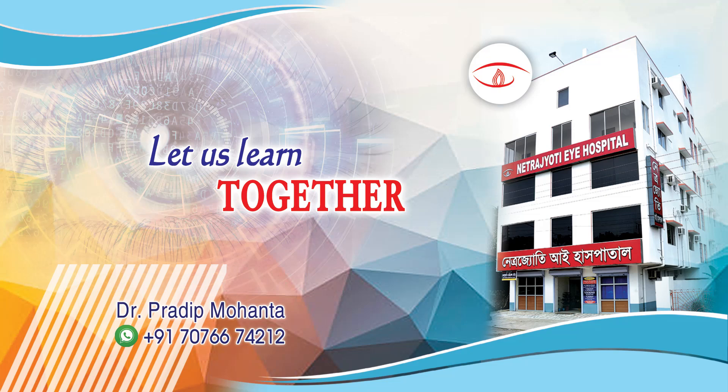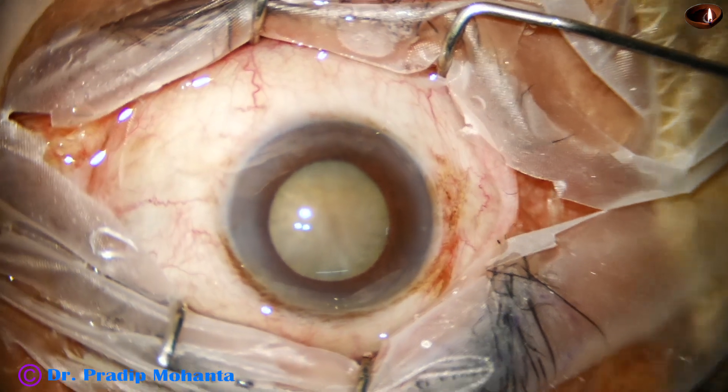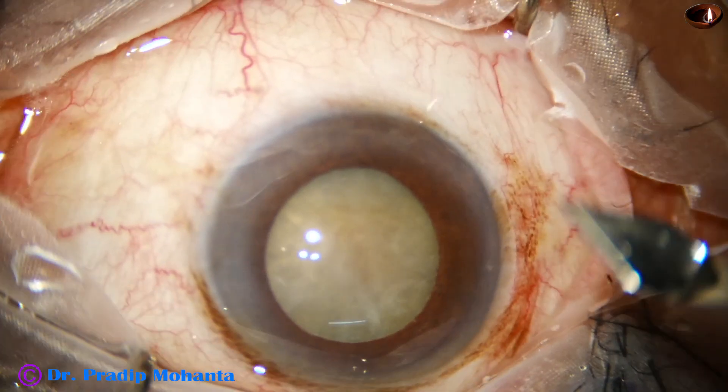Friends, welcome to my workplace for hands-on PHACO and SICS training. Let us observe this totally unedited PHACO surgery.